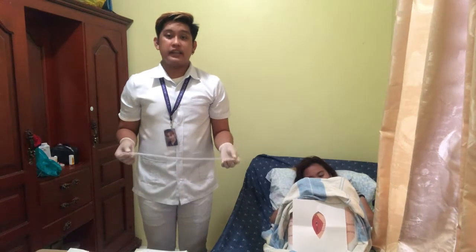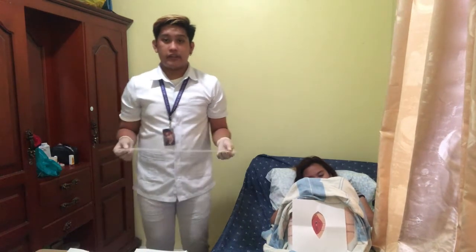After that, we'll now pick up the catheter at least 3 inches from the tip. Then place the thumb and one finger of the hand between the labia minora, then gently separate and pull it up.